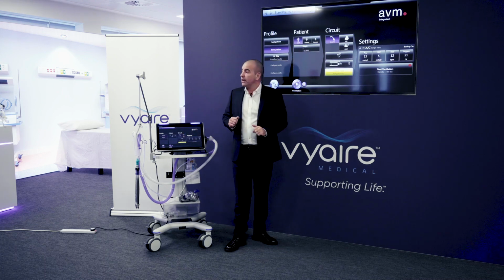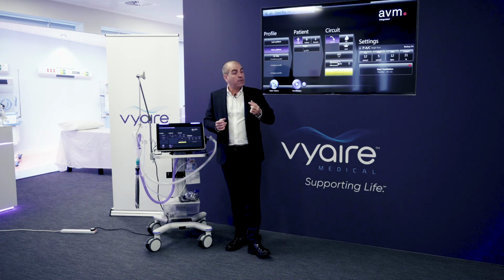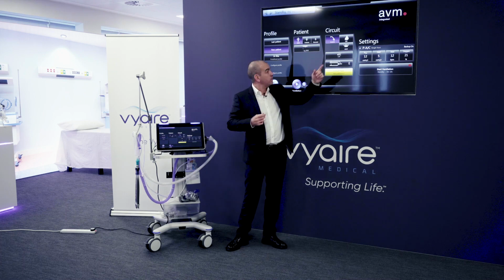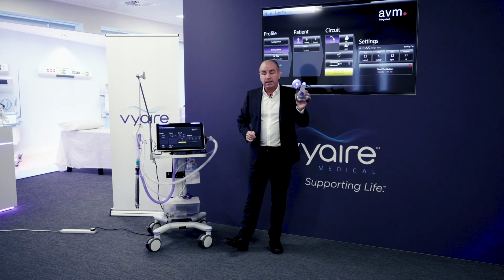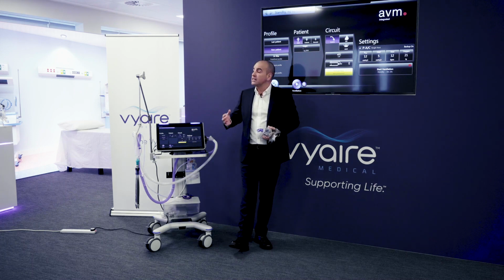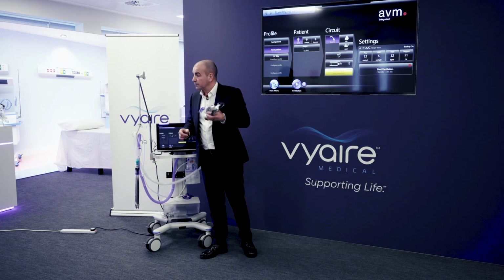you can choose whether you're working with a neonatal, a pediatric, or an adult patient, whether you're doing invasive ventilation, so that might be with having a breathing tube in the patient. When you then come to de-escalate the treatment, you might want to take the breathing tube out and put them on a mask. And we do the AirLife NIV masks, don't we? So the nurse, for instance, is not running around the department looking for a different device, a different circuit. You would just simply disconnect here and plug the mask on.